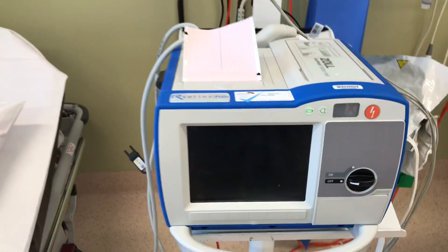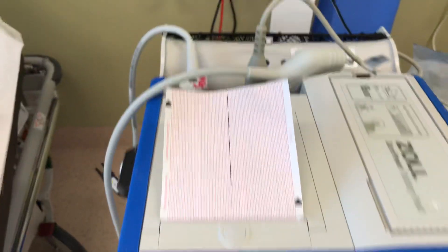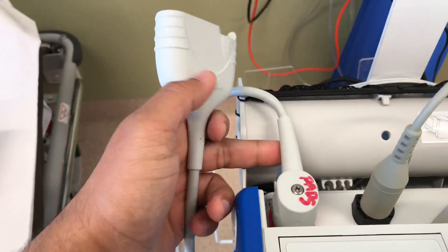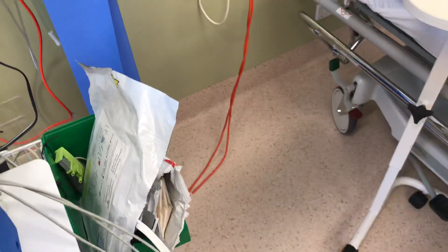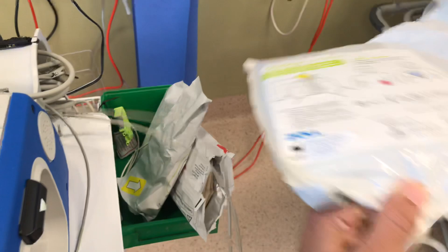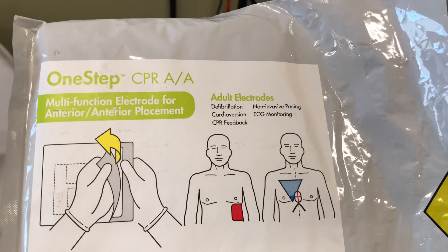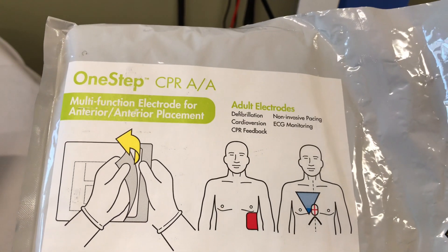Before we go over to the test, I'll just go through the other parts. We have two cables attached to this device. This cable is where the pads are attached, and this cable is where the 3-lead ECG is attached. If you look at the adult pad, we can actually do defibrillation, cardioversion, CPR feedback, non-invasive pacing, and 3-lead ECG monitoring.